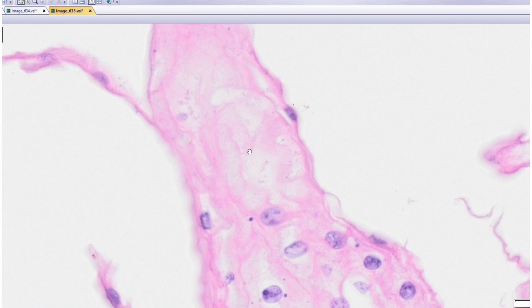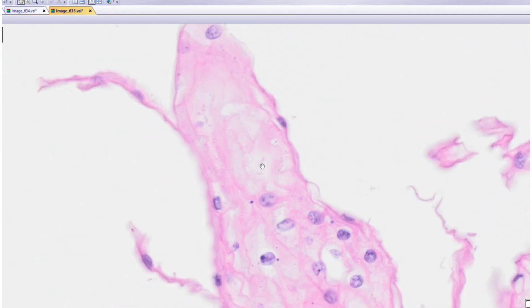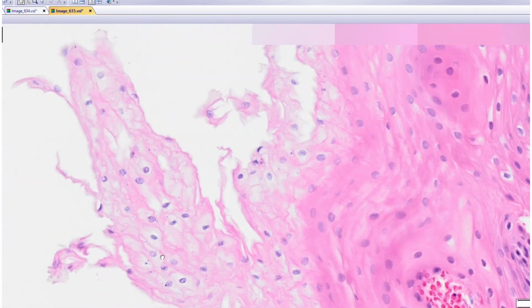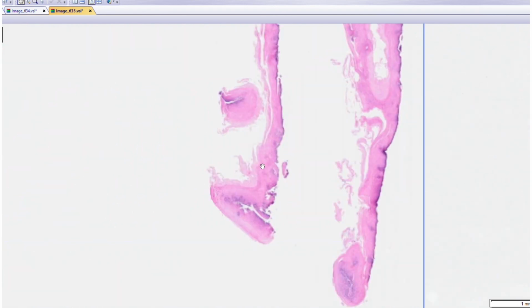But what we have here, inside here, is probably fluid and debris, and then you have all of these worm heads sprouting out from this central core. When you look at the adjacent cuts to see if you can see anything better, you don't really see very much in the cut before it and the cut after it.